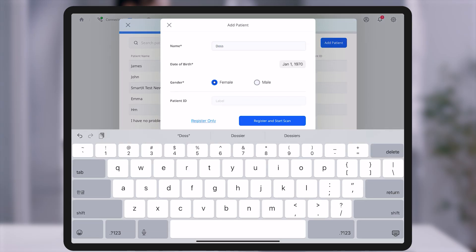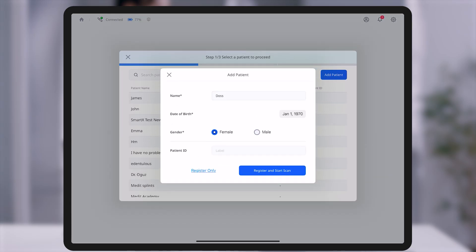Next, you will select the appropriate workflow based on the clinical objective before proceeding with scanning.